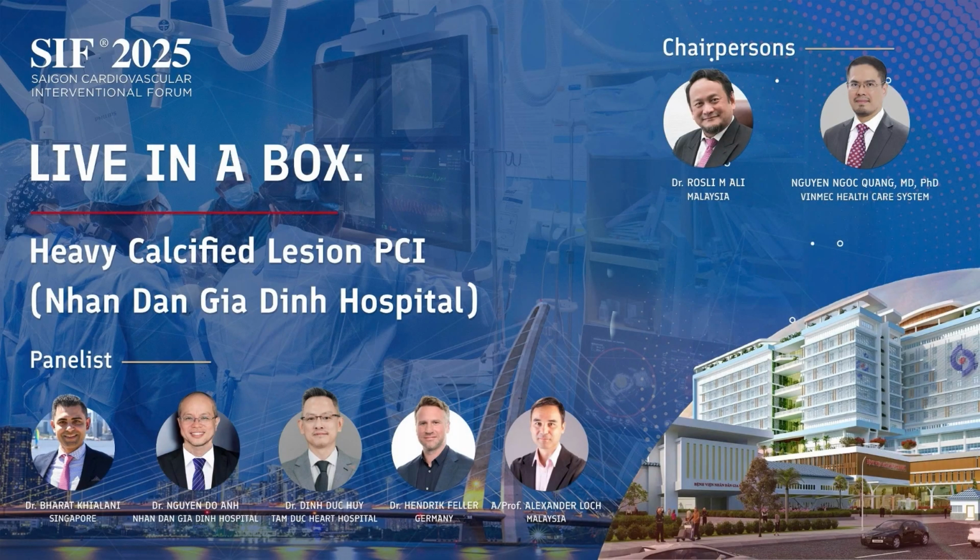We can see here, maybe you can put up the summary of the case on a slide so people can see it. So we would like to have opinions and comments from the panelists about how to approach this case. So maybe Dr. Huy first.